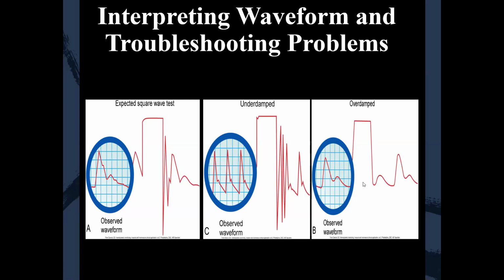Is the patient's wrist kinked? Is there an air bubble stuck in that line because somebody drew blood from there and got air in the line? So I've got to troubleshoot, because ideally we want to be here. We want that beautiful square and then a few oscillations, not this chaos in the middle. And if we have none at all, it's overdamped.